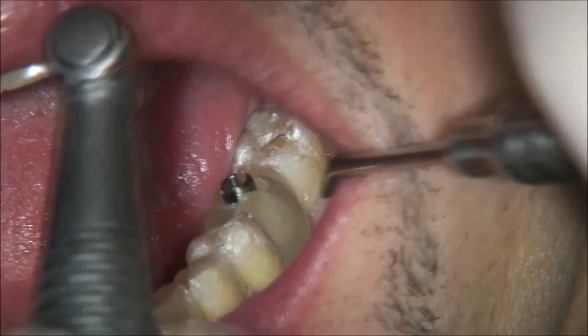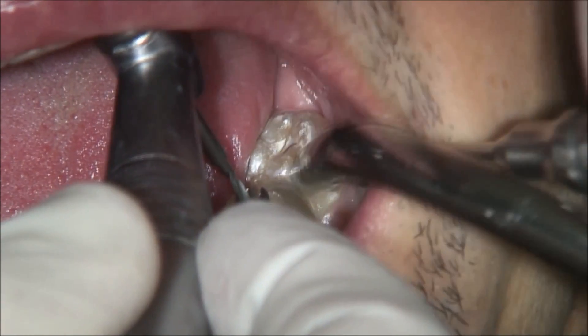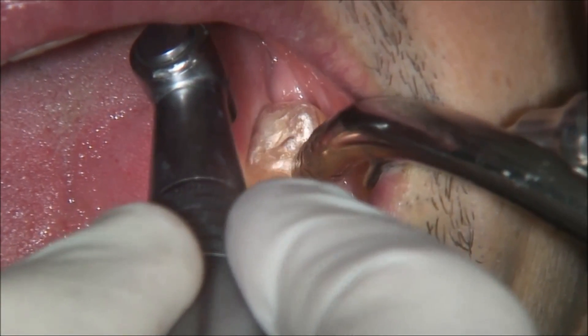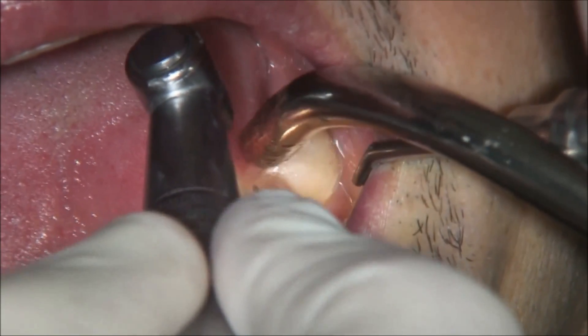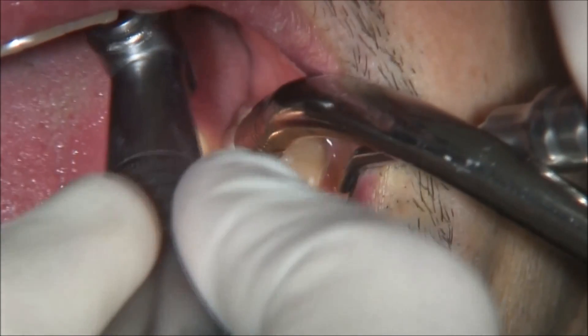Now we use the GPI sleeve, 1.5 mm diameter, with a 1.5 mm drill. We go to the final length and axis for the planned implant.